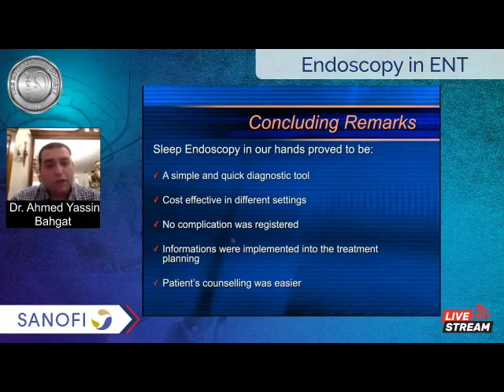The information that came from sleep endoscopy was implemented into treatment planning. We used the information to tell the patient what the treatment plan is, what about the surgery, what are the other options than surgery. And patient counseling was much easier using a video recorded by sleep endoscopy to show the patient.